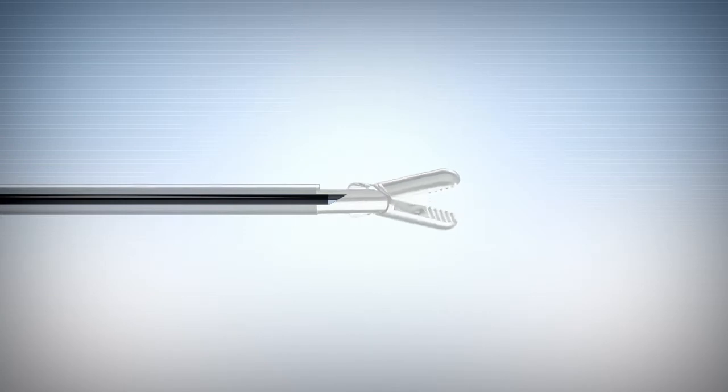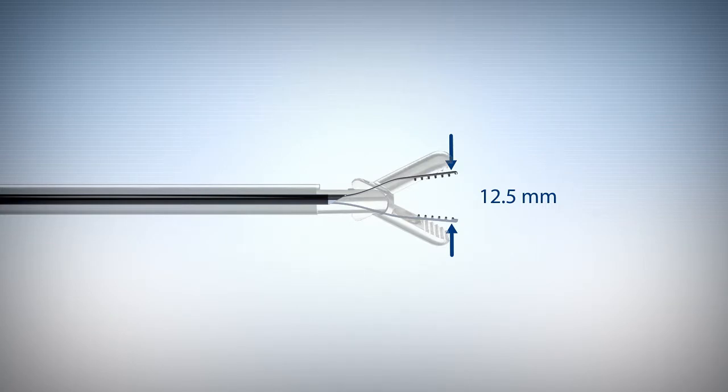The grasper jaws open up to 12.5 mm to grasp difficult structures like distended gall bladders and the proprietary steel shaft provides the strength and rigidity necessary for secure tissue retraction.